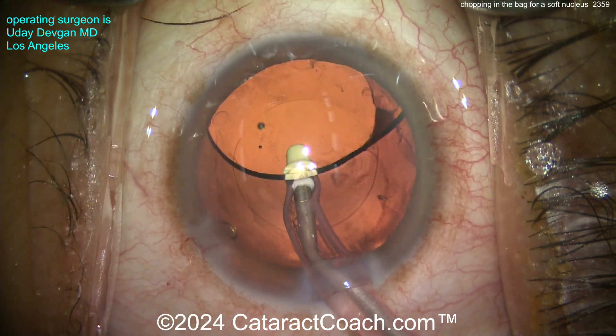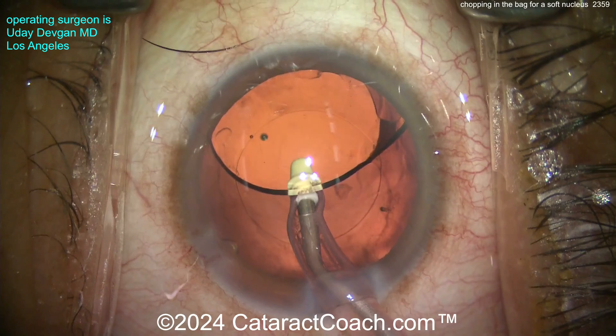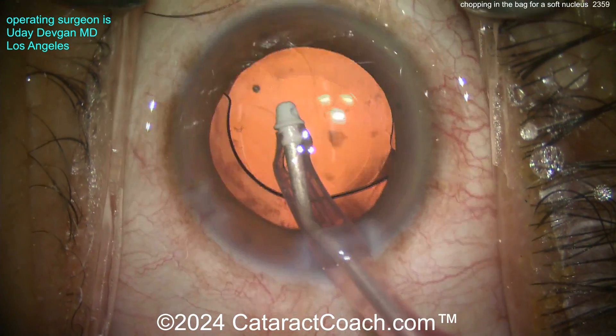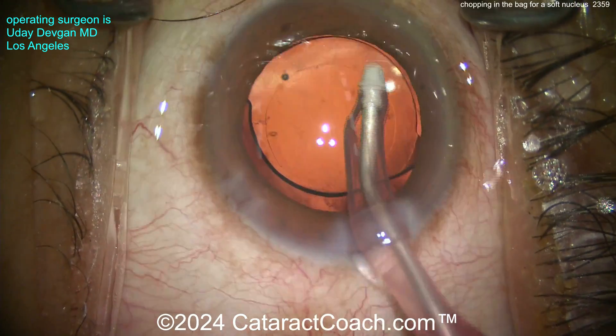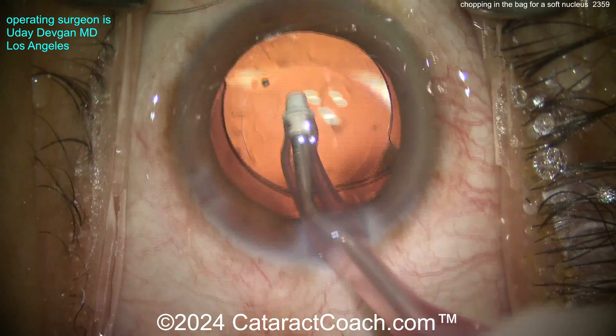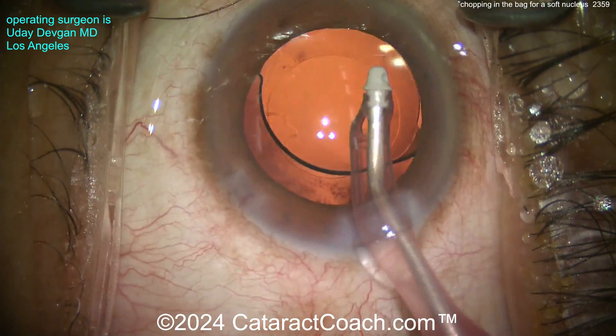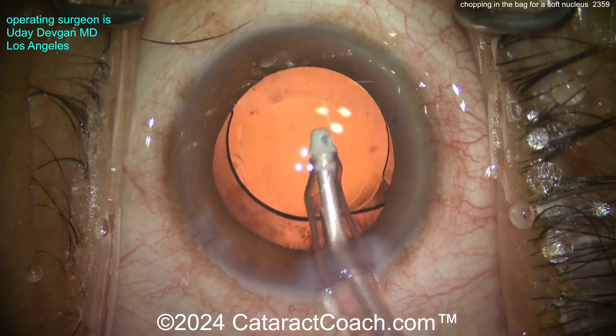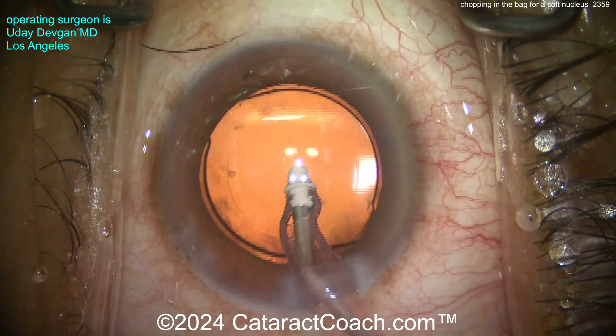Maybe it looks slightly smaller than five millimeters. Let's go behind the IOL and remove the viscoelastic from the bag — get this all centered up. Nice technique here; the patient has a beautiful outcome. Remember, you can have a situation like this where you didn't pop it out of the bag — you don't flip the nucleus, you leave it in the bag and you're able to just chop right in the bag.